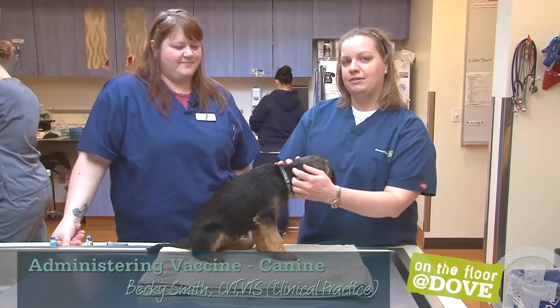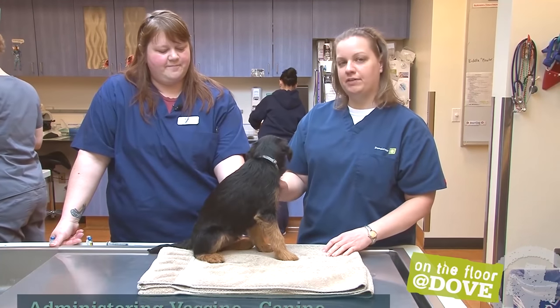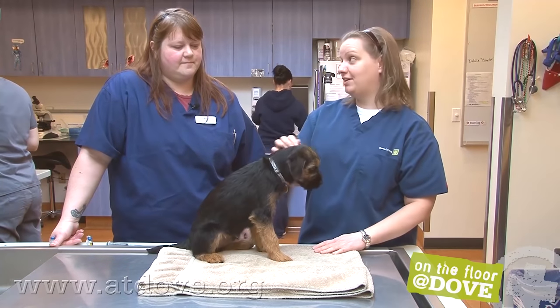Hi, I'm Megan, and today we're here with Becky, who is a CVT and VTS in clinical practice, and we're visiting Rose City Veterinary Hospital. Today Becky is going to talk about vaccinating this puppy.